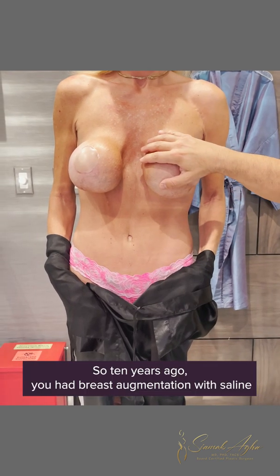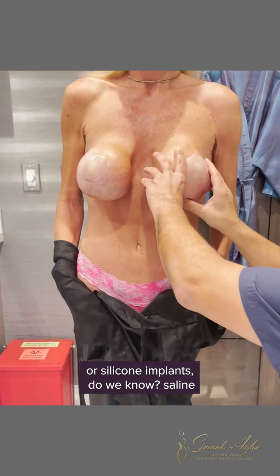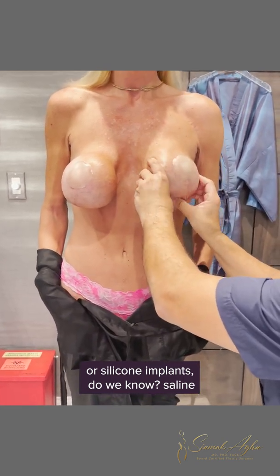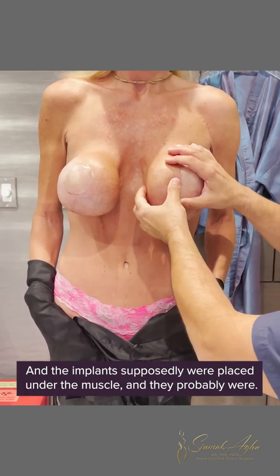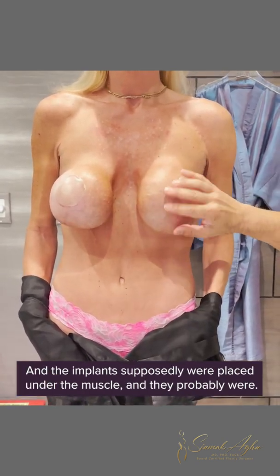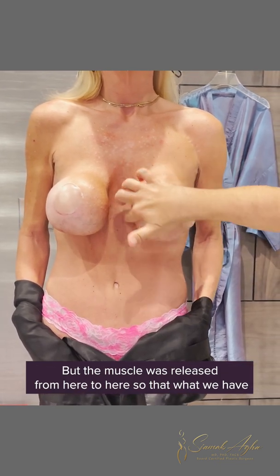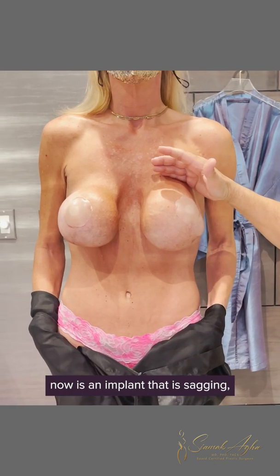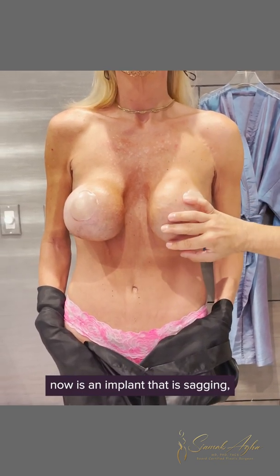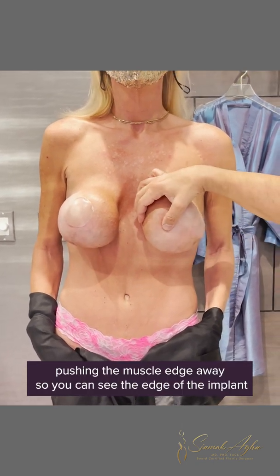Ten years ago she had breast augmentation with saline implants. They feel like saline implants and the implants were placed under the muscle, but the muscle was released from here to here, so what we have now is an implant that is sagging, pushing the muscle edge away so you can see the edge of the implant.